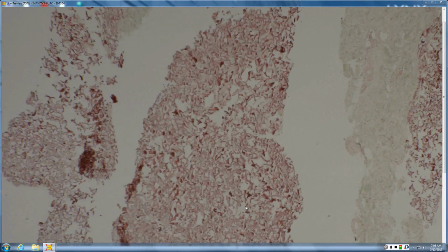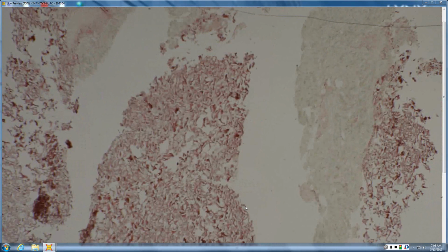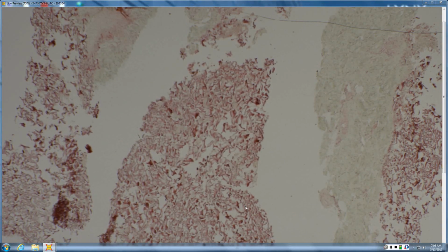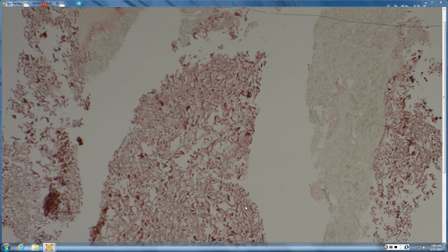Okay, this one is Gelfoam, and is a good one to know because stuff like this you absolutely can see. Maybe it'll be a picture slide on the boards, or it could be a real slide. But that's why we go through some of these exogenous things, because they're very much testable.